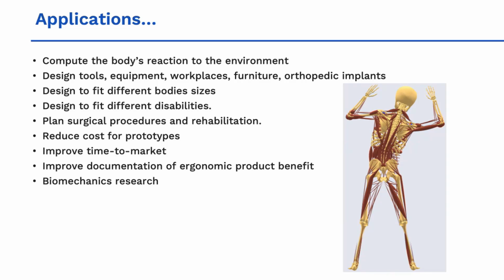And using musculoskeletal simulations, you can design to fit different body sizes and different disabilities. You can plan surgical procedures and rehabilitation programs as well. You can reduce the cost for prototypes. That's really the main thing when we talk about simulations.